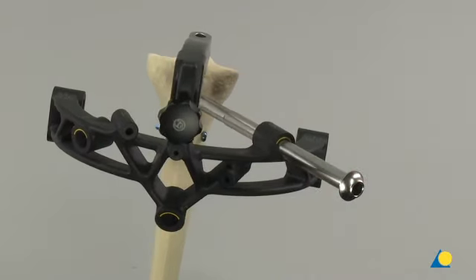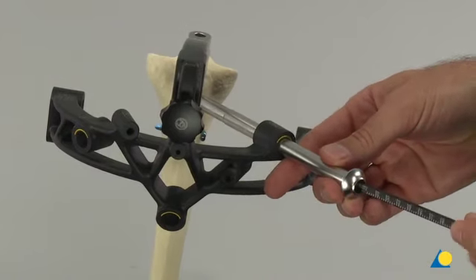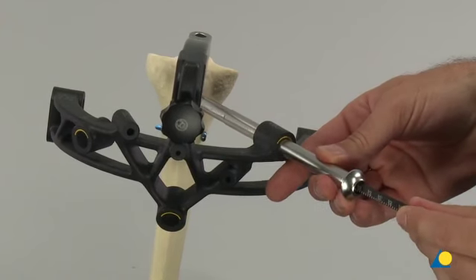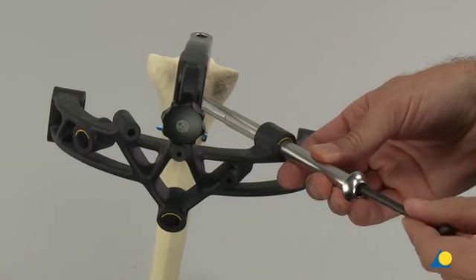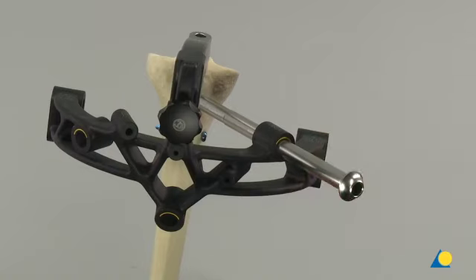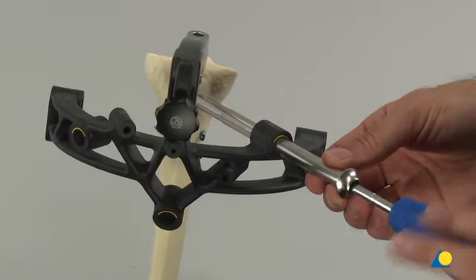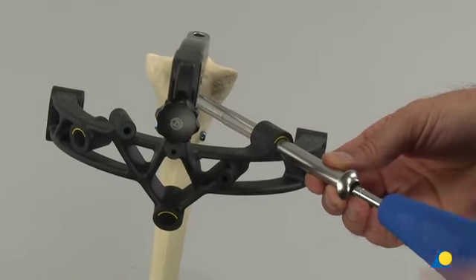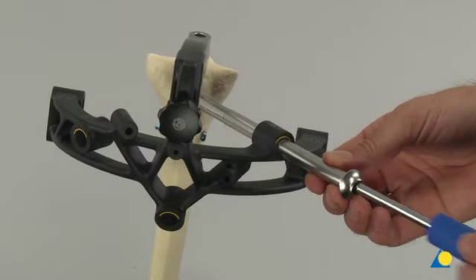While ensuring that the protection sleeve is pressed firmly to the bone, the measuring device is slid through it, making sure that the hook grasps the far cortex. The length of the screw is determined by reading the measurement at the back end of the protection sleeve, in this case 45 mm. The 5.0 cancellous bone locking screw is inserted through the protection sleeve and threaded into the hole with the screwdriver star drive T25, taking care not to over-tighten. Once the screw length has been verified, the screwdriver and protection sleeve are removed.